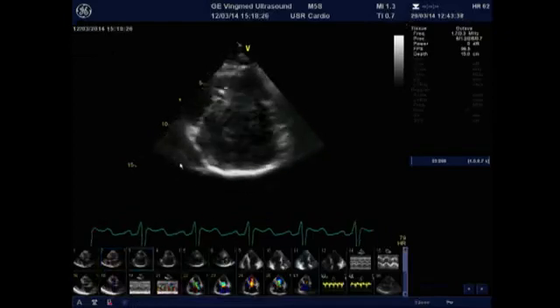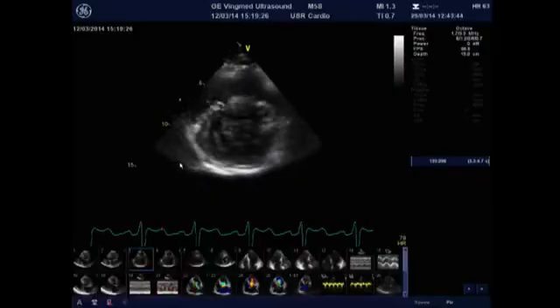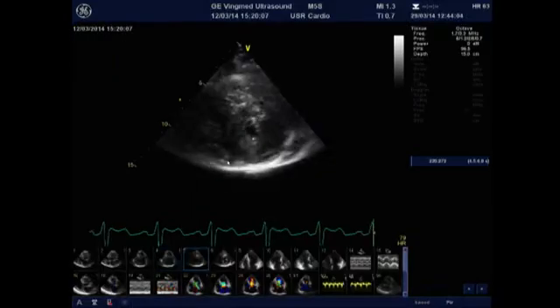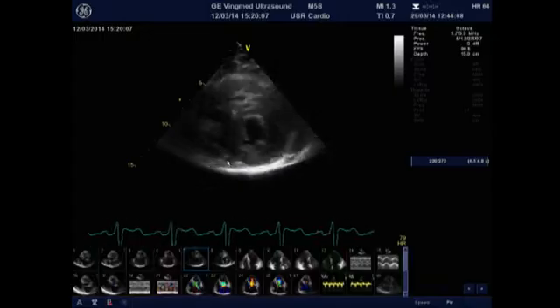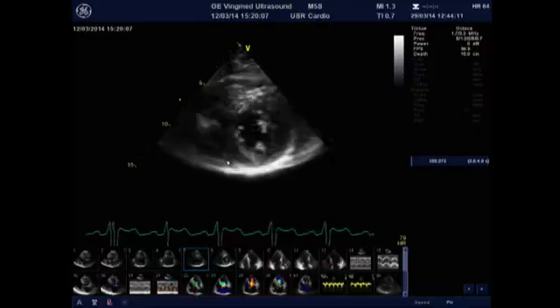In the same view, but in the short axis now, we must always try to quantify wall thickness. This is a cine loop, and afterwards in the still frame we try to measure every segment and to assess the maximum wall thickness. With the transducer pointing a little bit lower to the apex, at the level of the papillary muscles, we must do exactly the same thing.